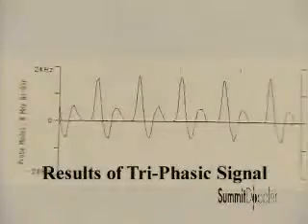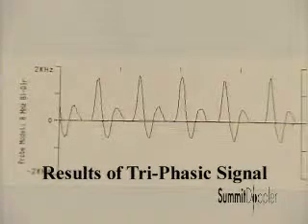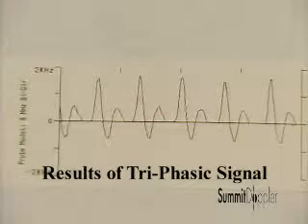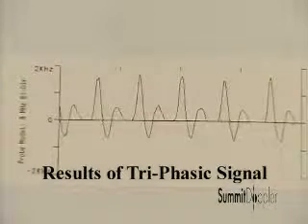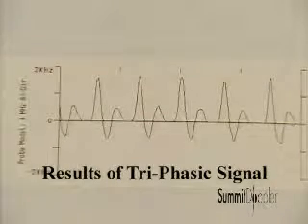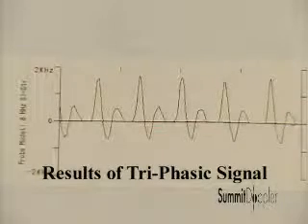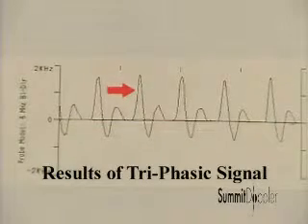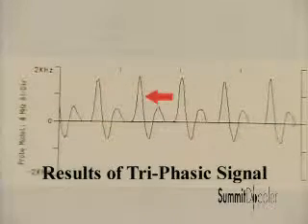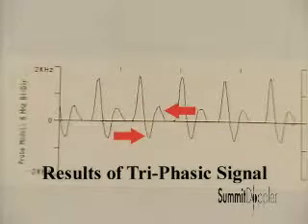The single-level lower extremity physiologic study combines the diagnostic value of the ankle brachial index with Doppler waveform analysis. The normal Doppler signal is pulsatile and multiphasic. Here is a set of normal waveforms from the posterior tibial artery. The systolic acceleration and deceleration are rapid. These waveforms are triphasic with 2 diastolic components.